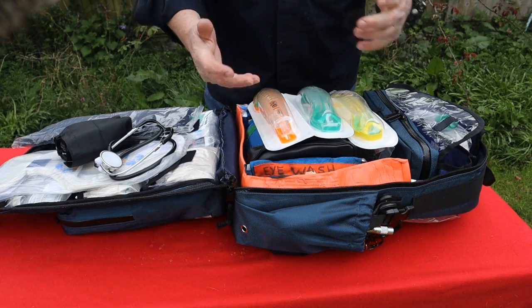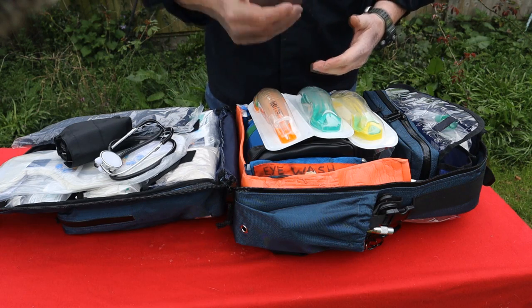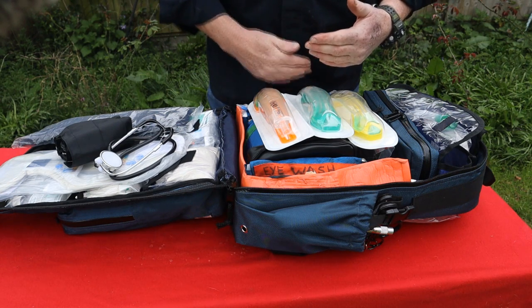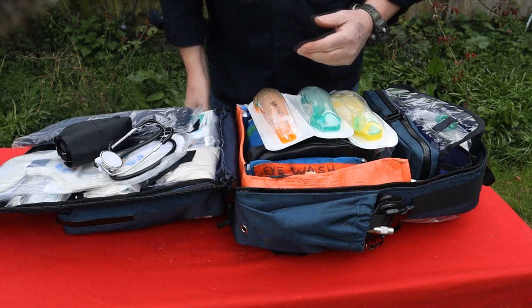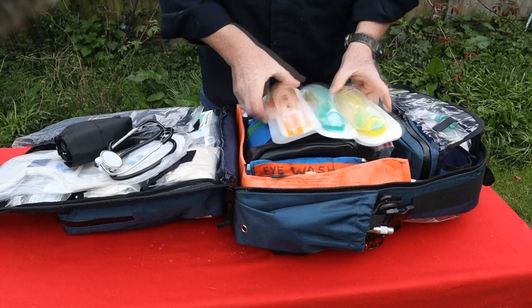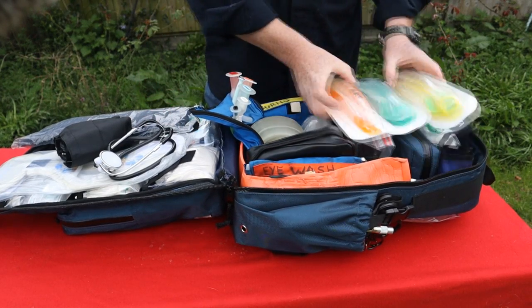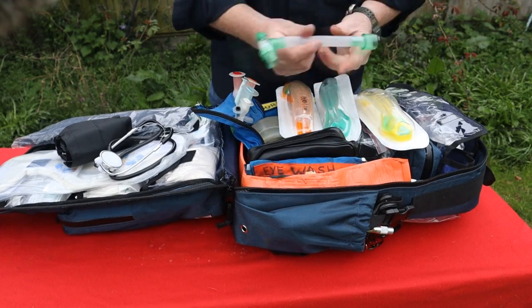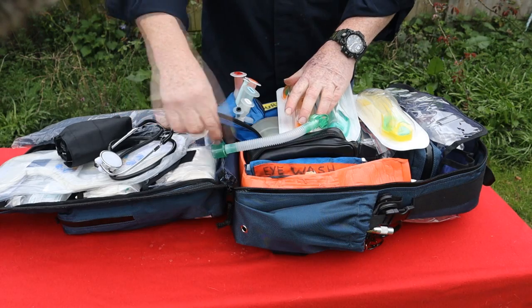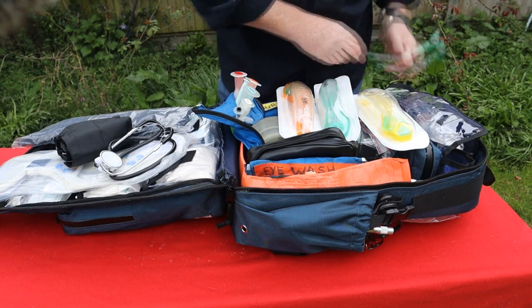We get the patient on their back, sniffing the morning air, jaw slightly raised. This will slide in, and you're going to put it in from the very top of the head, and on that goes our CO2 monitor, clips on here. And then we have a disposable piece of kit that goes onto the end of the tube, and that goes onto the bag valve mask. All of this is disposable, so there's no risk of cross-infection.